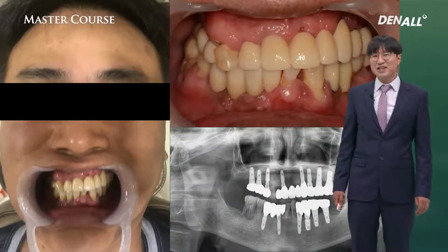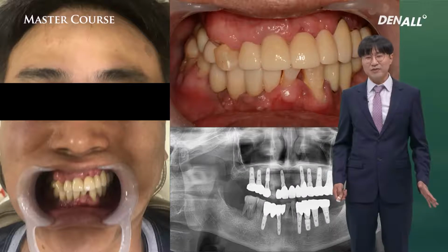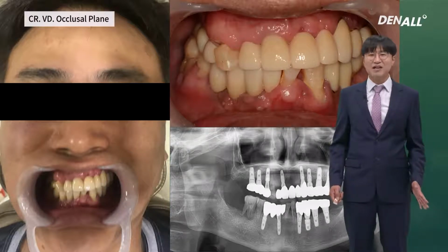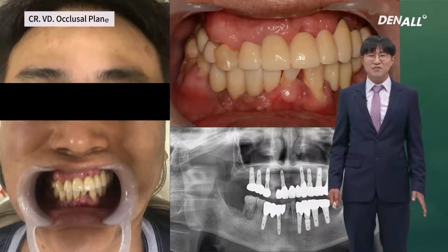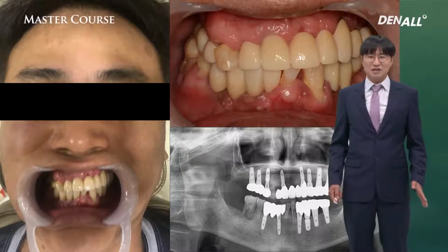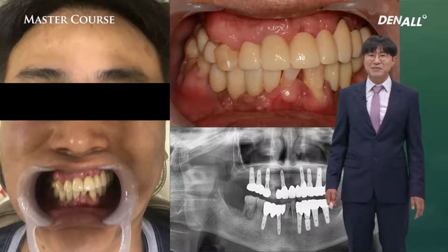In the early days of my clinical practice, I didn't understand properly the occlusal plane, so I did not give proper information to a lab. This is due to a dentist's fault, resulting in disastrous outcome like this. Fortunately, the patient didn't complain about aesthetics, so it has been used pretty well for the last 10 years. But whenever I see this case, I still suffer.